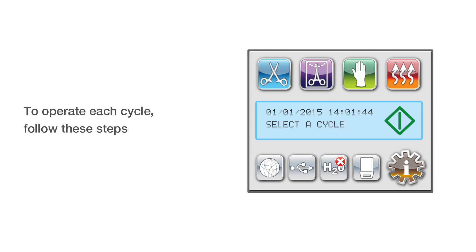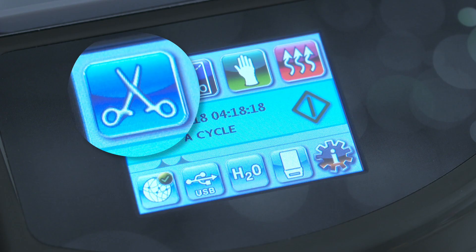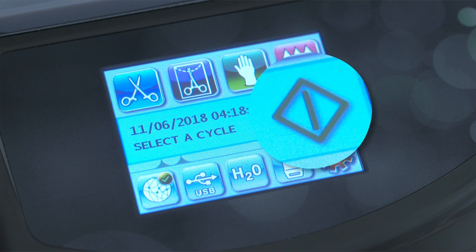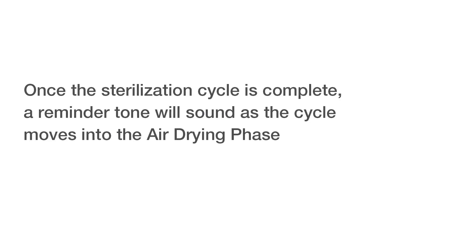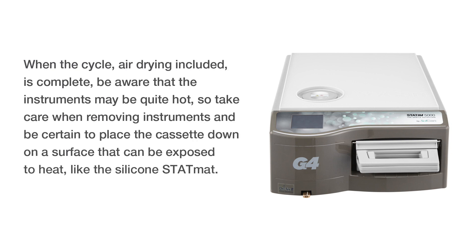To operate each cycle, follow these steps: turn the power switch at the back to on, press the appropriate cycle on the touch screen, and press the start icon. Once the sterilization cycle is complete, a reminder tone will sound as the cycle moves into the air drying phase. When the full cycle, air drying included, is complete, be aware that the instruments may be quite hot. Take care when removing instruments and be certain to place the cassette down on a surface that can be exposed to heat, like the silicone stat mat.